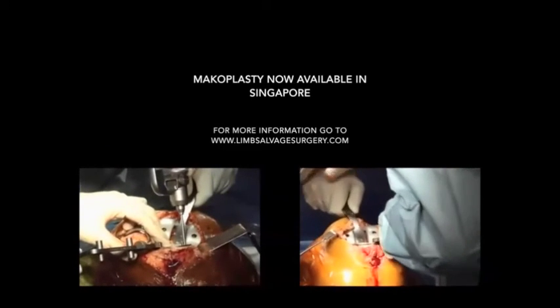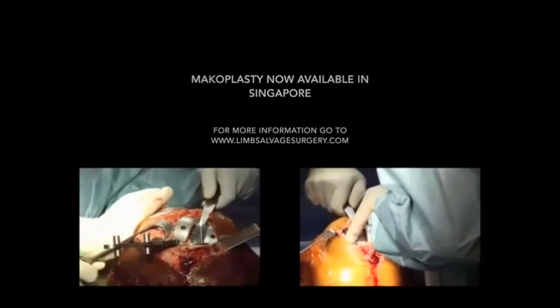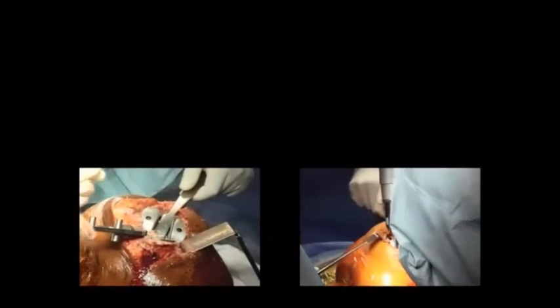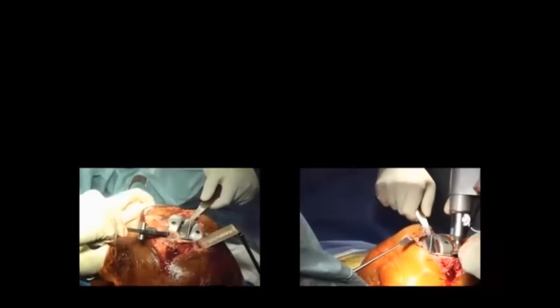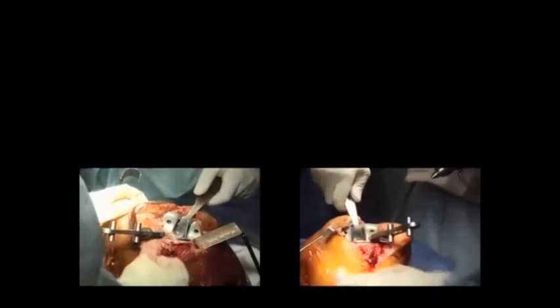I am now putting in the tibial implants — the tibial tray — at the bottom. Once again I would like to stress that this isn't an advocate of any one method; it's simply a comparison to show how the two technologies are quite different even if they are both knee replacement surgeries. Thank you very much for watching.